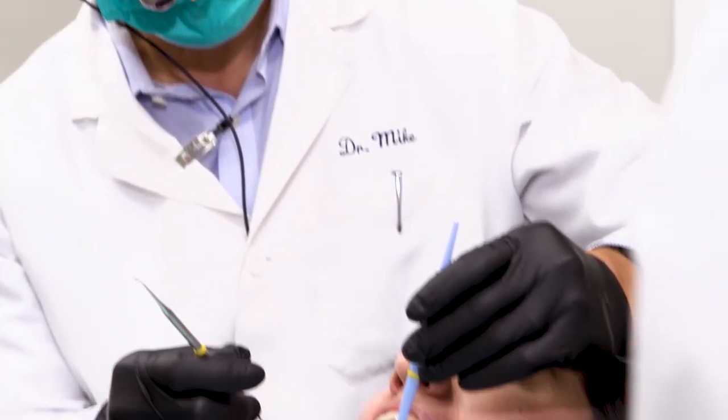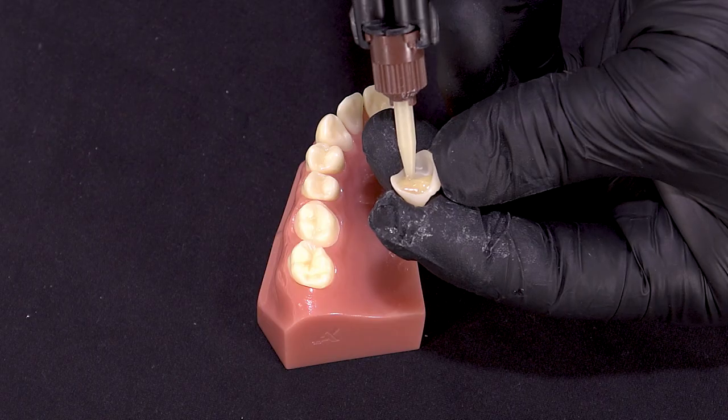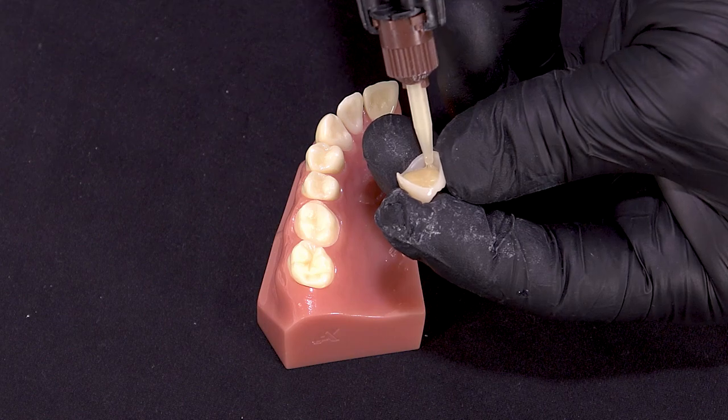With this product we're saving a lot of chair time because of its short and simple application. What's impressive is its reliable bond strength and that's what I count on.